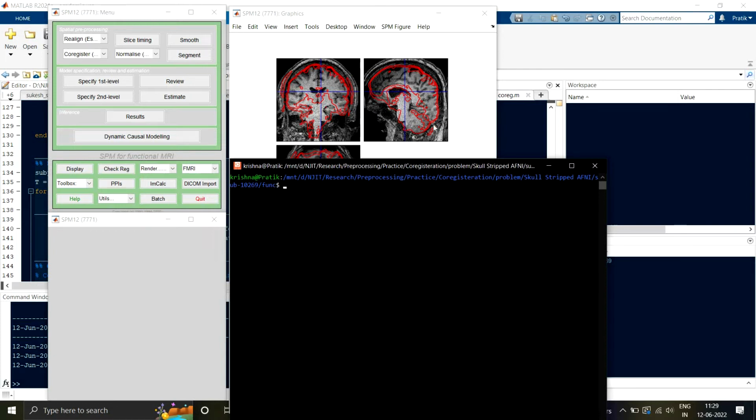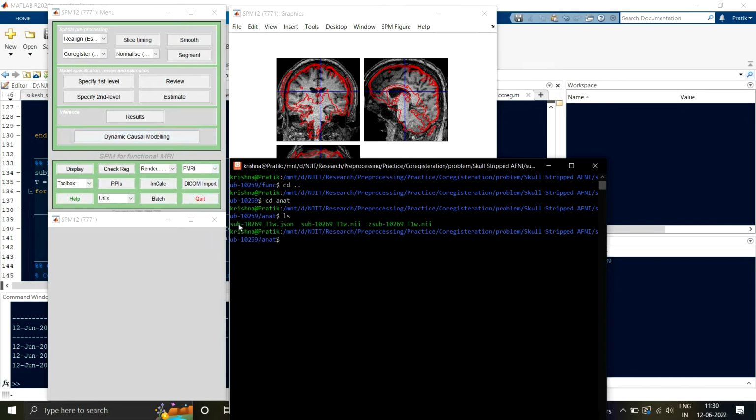So first let me show you the name of the anatomical image. Let me go to the anat folder. So here I am in the anat folder, and this is the name of this particular anatomical file. What you have to do is type bet2 for FSL. So bet2 will use FSL. Okay, bet2 is brain extraction. Then type the subject name or the anatomical image name that you want to skull strip.